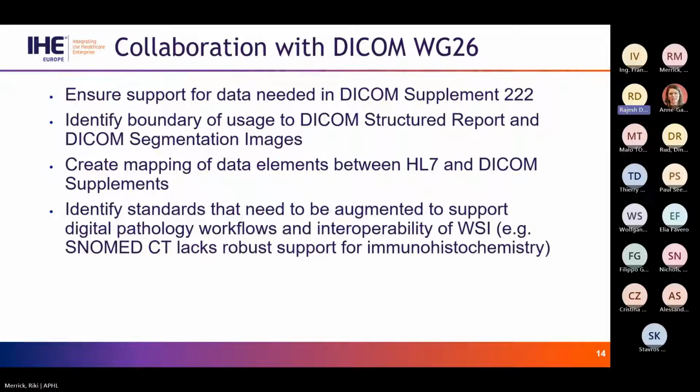And one example is given there of lack of discrete coding for immunohistochemistry, so challenging to understand what is the whole slide image that's being interpreted from a machine understanding standpoint. At least we still, in today's day and age, have to have a human looking at the label on the glass slide to understand how to interpret that slide. Next slide.